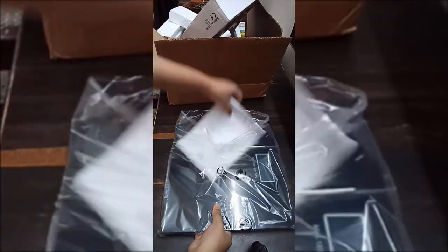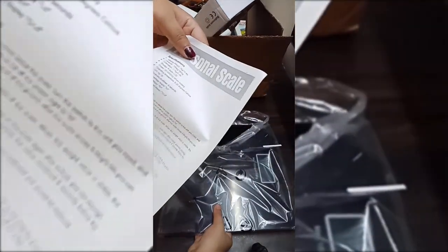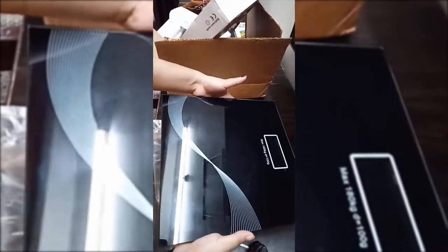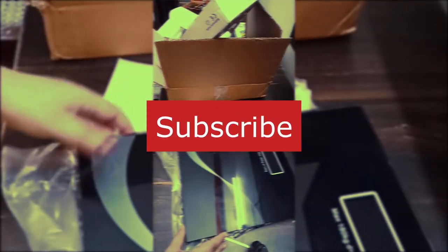Now we will see what is given in the box. There is a paper and instructions — what are the things included. Now we will finally remove it and see how beautiful this machine is.